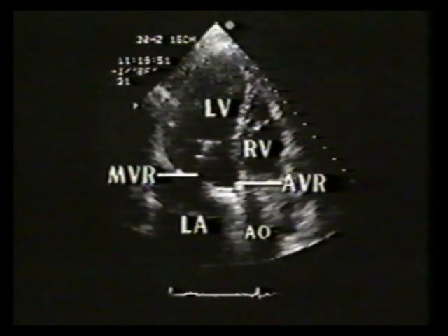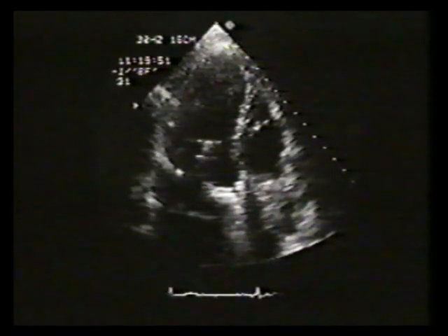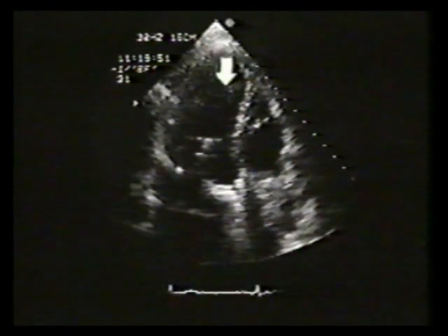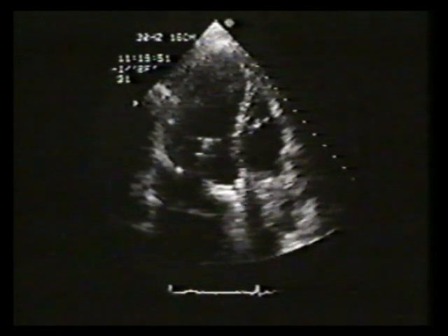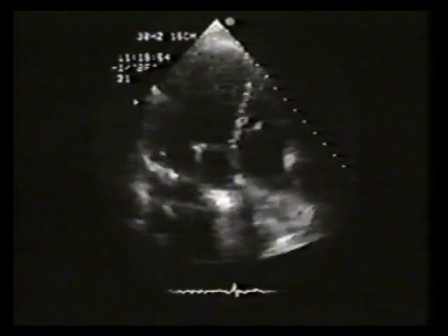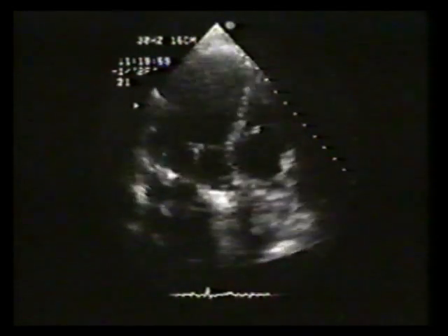This is an apex up, apical long axis view from the same patient. In order to determine the left ventricular outflow tract velocity, it is important to align the image such that the Doppler cursor can be dropped straight down the screen and be parallel with flow in the LVOT. By properly aligning the image like this, we avoid an angulation error in the measurement of the LVOT velocity.